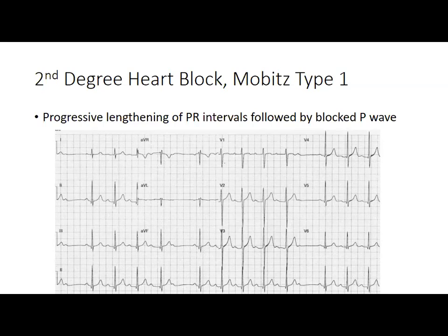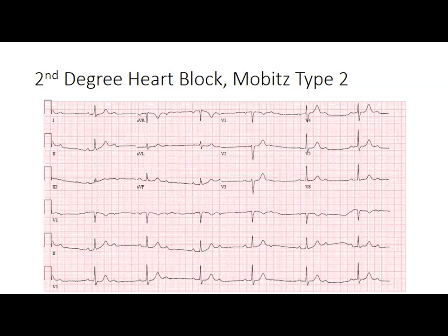So it's pretty straightforward in terms of your assessment, and when you see this, it's are you having any symptoms from this at all? If they are, cardiology should evaluate them for a pacemaker. If they're not, they do not need to be consulted.